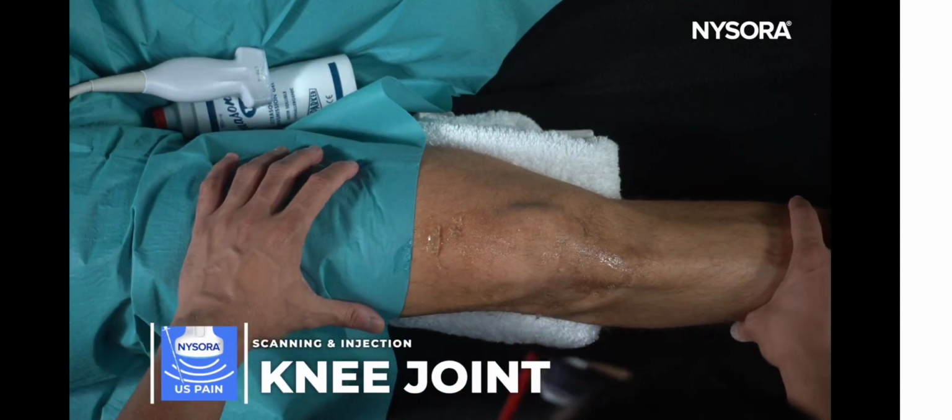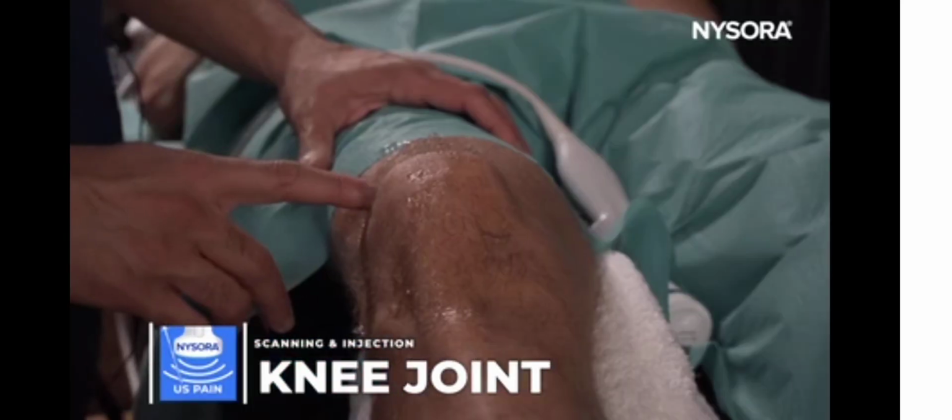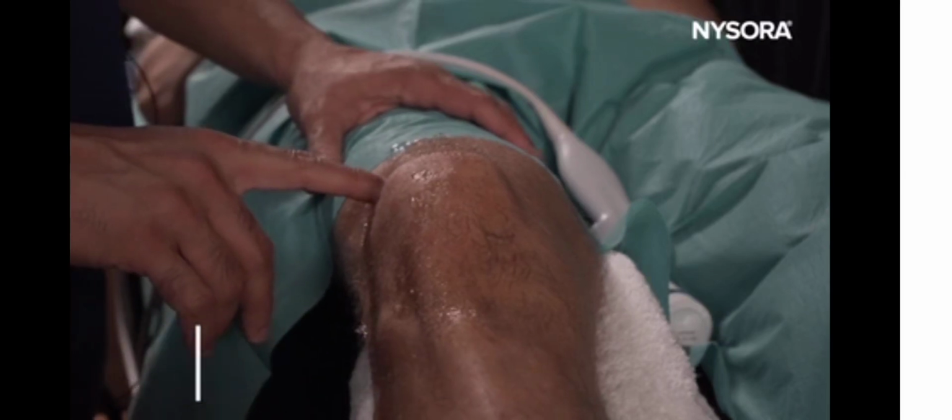Thank you. I'm going to talk to you about the intra-articular injection of the knee joint. This is usually performed in the suprapatellar recess of the knee joint.